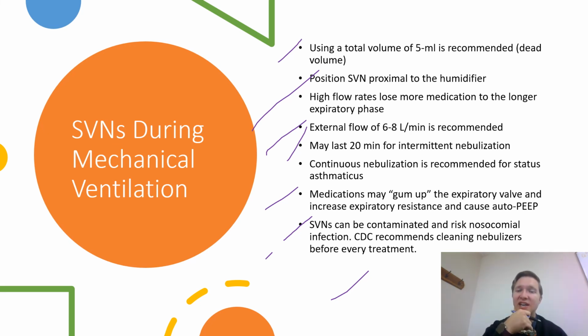So the CDC does still recommend cleaning the nebulizer before every treatment. That's why they say, hey, before every treatment, rinse it out, make sure you get all that dead volume out of there, all that stuff. Every once in a while, you'll see people just add medications to whatever is already in there in the dead volume, and that just builds up concentration and concentration and concentration. Not appropriate, because then you don't know really how much medication your patient's actually getting, right? You want to know how much your patient's actually getting.